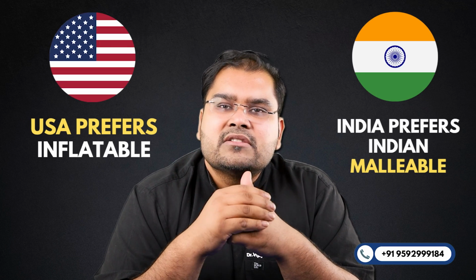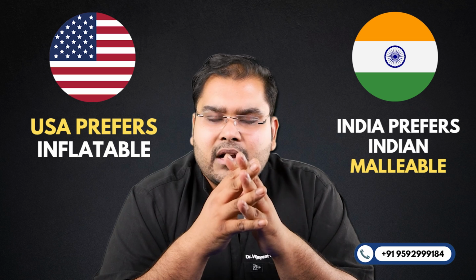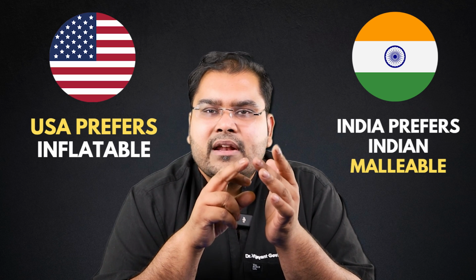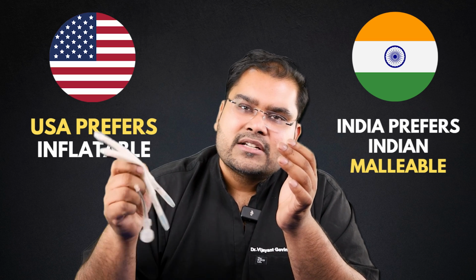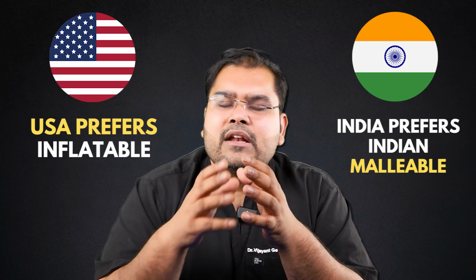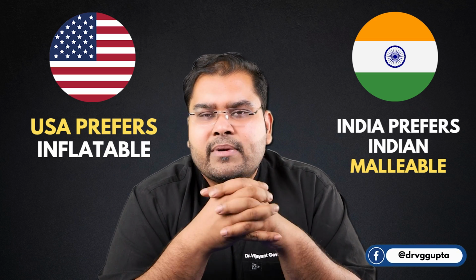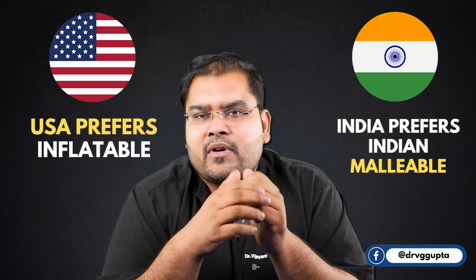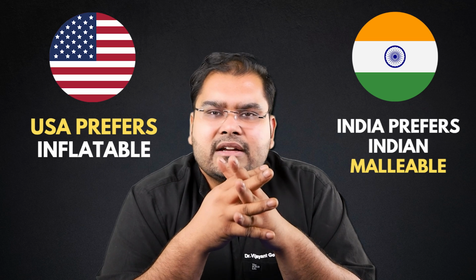So all in all, if I would say the gold standard implant, the implant that is utilized everywhere around the world, is the 3-piece. But it is not because the 3-piece is a better implant. It is because the 3-piece is what the American surgeons are primarily trained in. But for many men, older men, younger men, men looking for more hardness, men with big penises in whom these implants tend not to give good support, men who want an easier life, or men who want a lifelong implant, or men who do not want the entire problem of locking and device malfunctions, the Indian implant could be an extremely good choice.